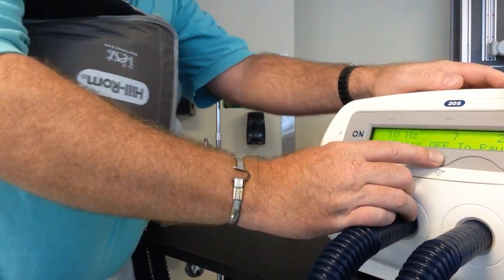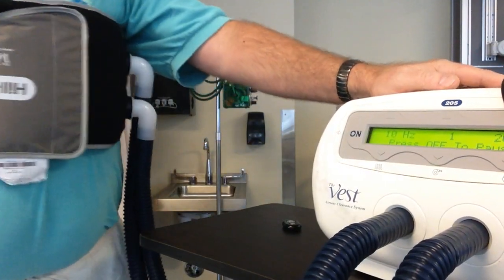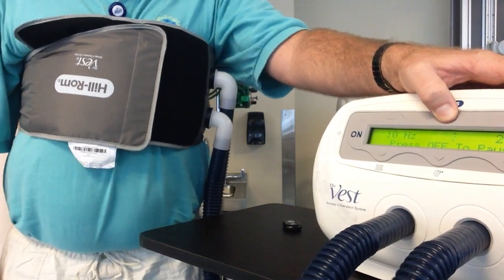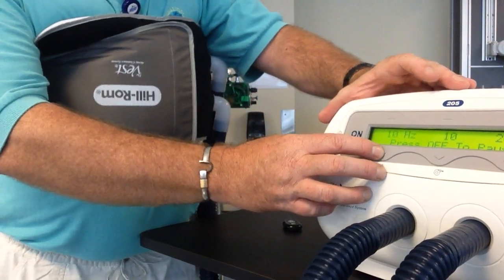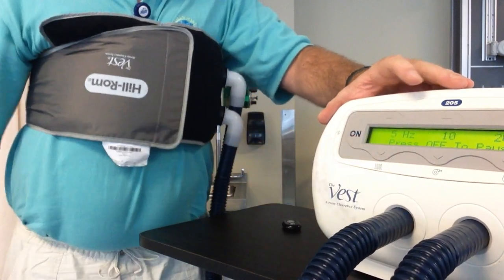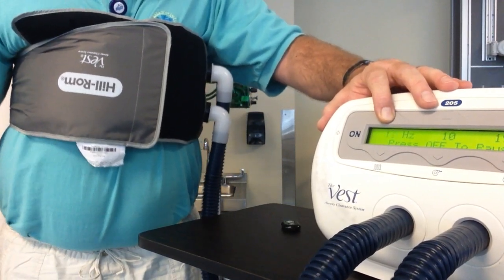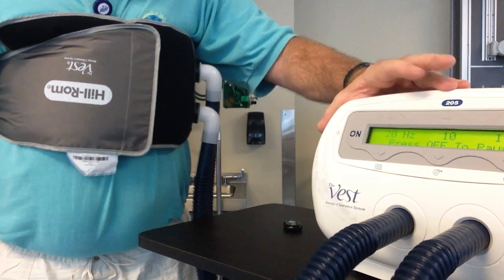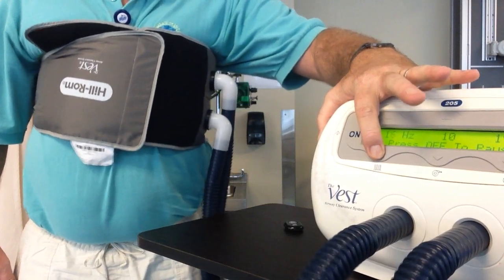So if it's too hard, you can decrease the intensity while it's running. I just decreased it to 1, and you may be able to see, if not hear it in my voice. I take it back up to 10. It's hitting a little bit harder now. And then with the 10 hertz, you can actually see it goes down to 5. You can actually see how much less it's hitting. If I take it up, you can really go up. 20 is the max hertz. That's a little much.